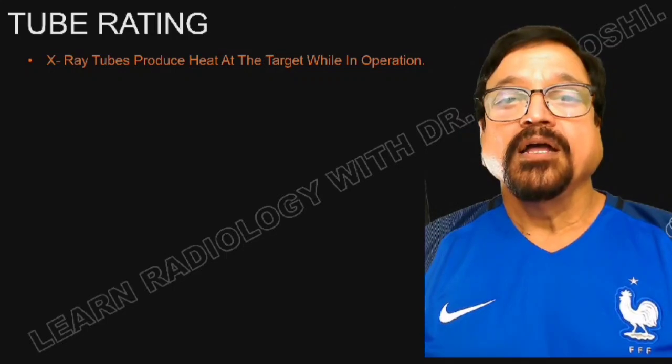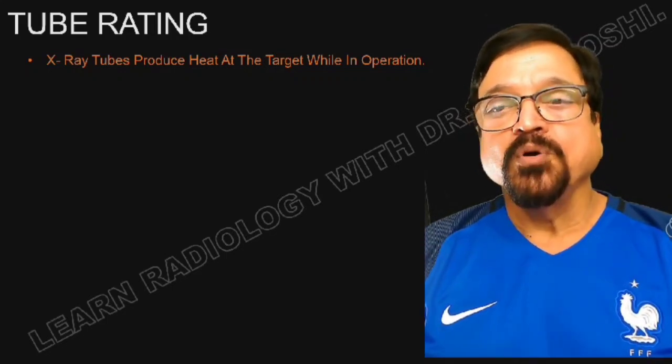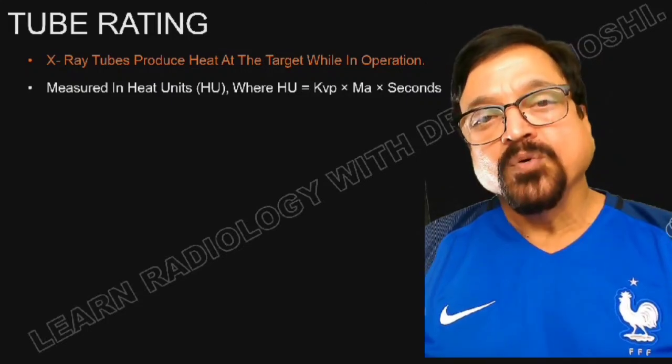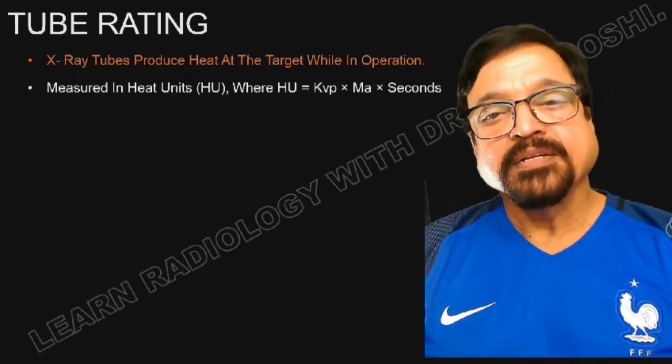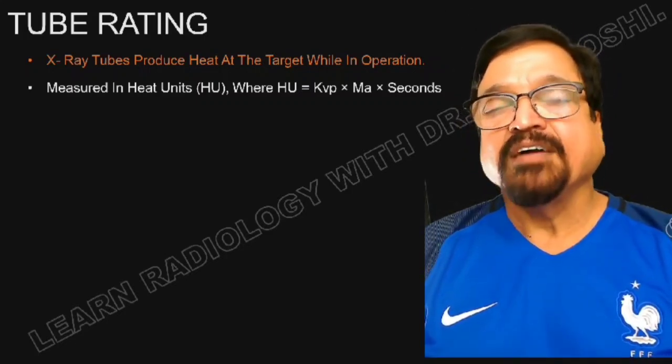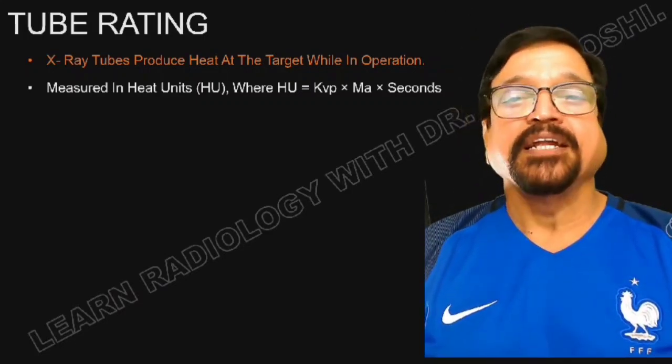Now tube rating, one has to understand. Tube rating is the maximum exposure you can achieve from the tube, or whether the tube can be used successively for multiple exposures. Now this will depend on multiple factors.